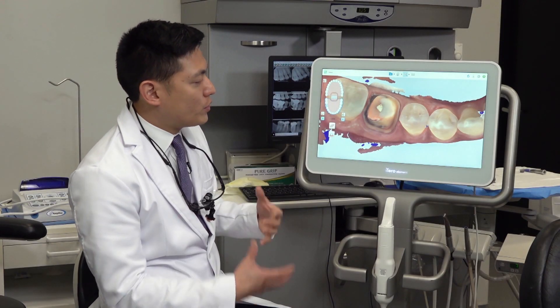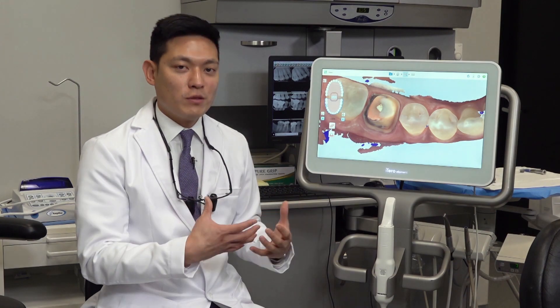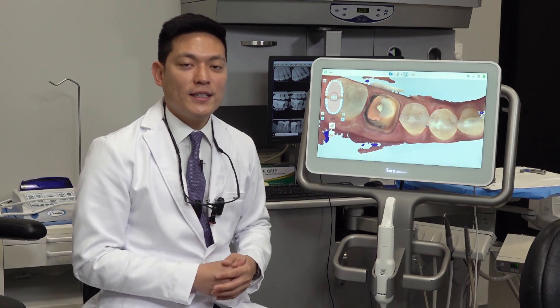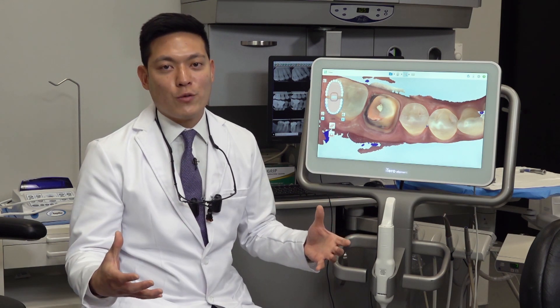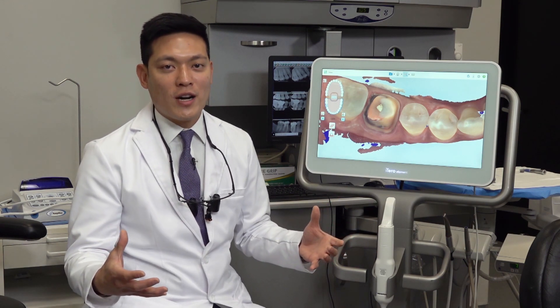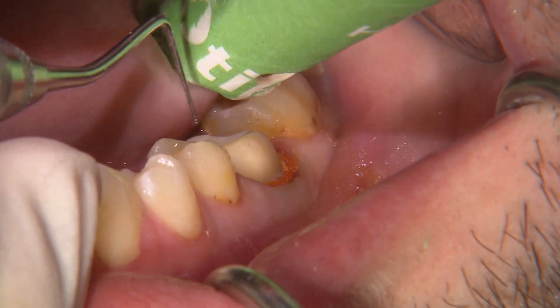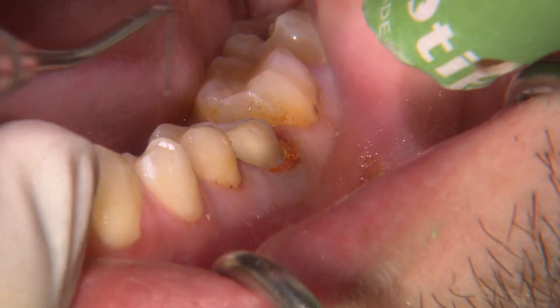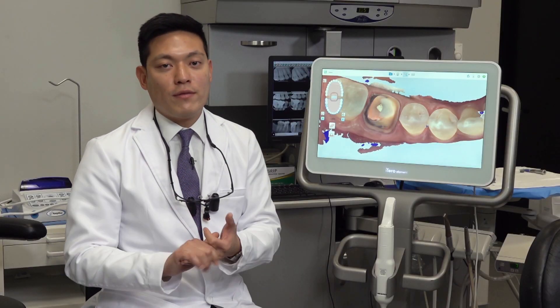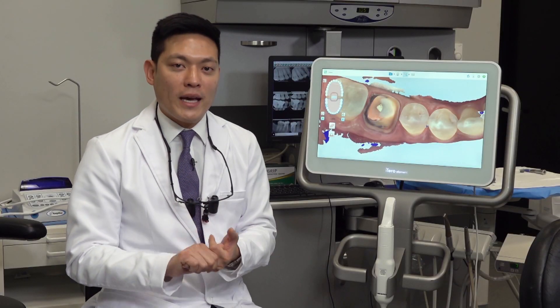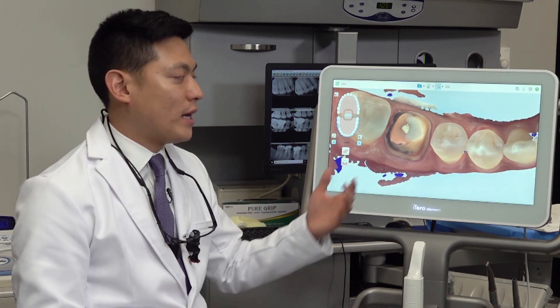Now for the margins, you want to make sure that the margins are visible and they're clean. For those equigingival or even subgingival margins, adequate retraction must be accomplished — whether you're using laser, retraction cord, or retraction pastes — some method to move the tissue away from the prep so that the margins are visible.